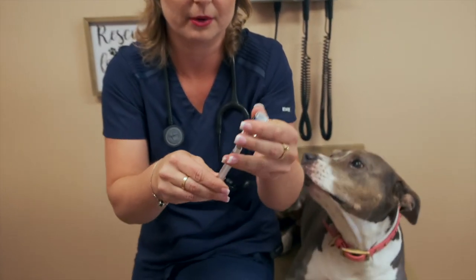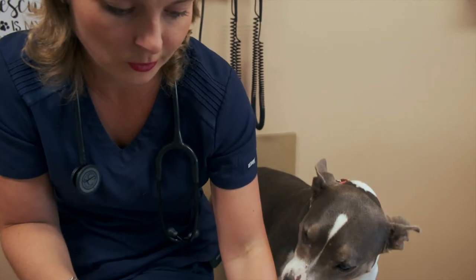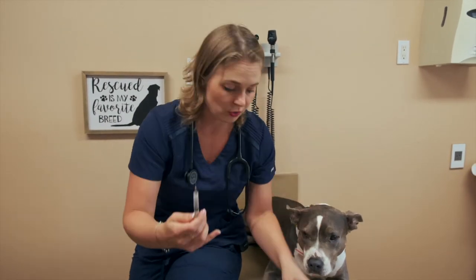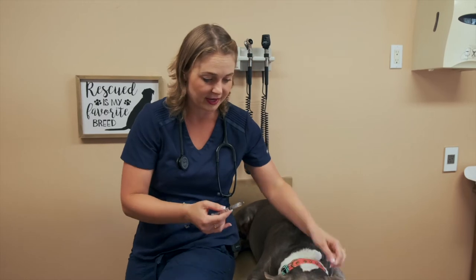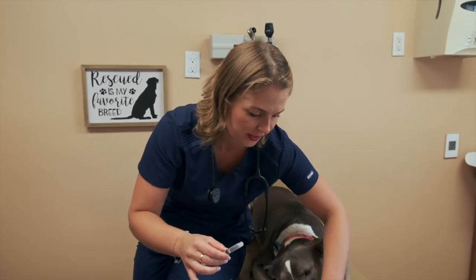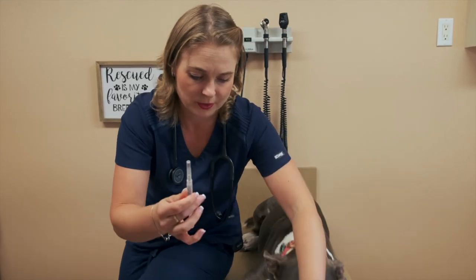If you're scared to give a sub-q injection, go to your veterinarian and have them do it. Now let's get started — we're going to draw up some allergy shots here. Bella gets two vials of this allergy shot, so I'm drawing both of these up into my 3cc syringe. I'm also going to change out my needle, because I just poked through two rubber stoppers and that will dull the needle. I want this to be as painless as possible, so I'm putting on a fresh needle.